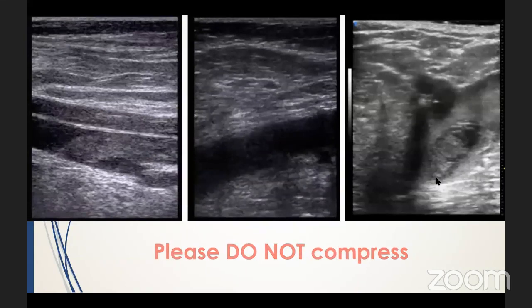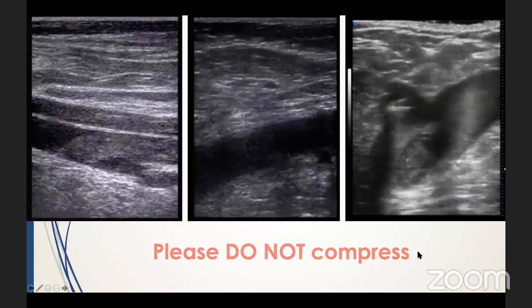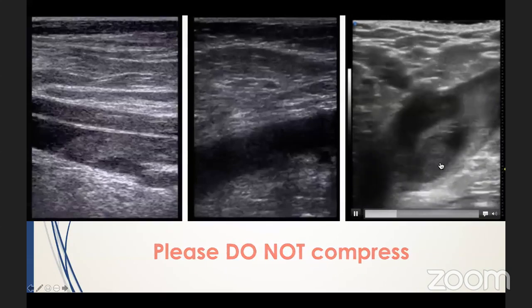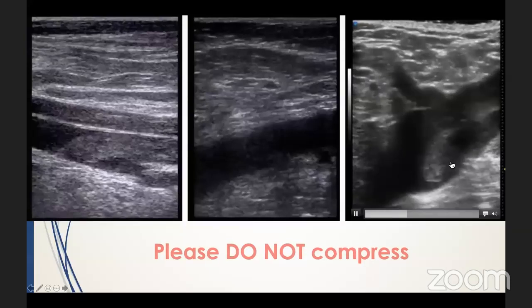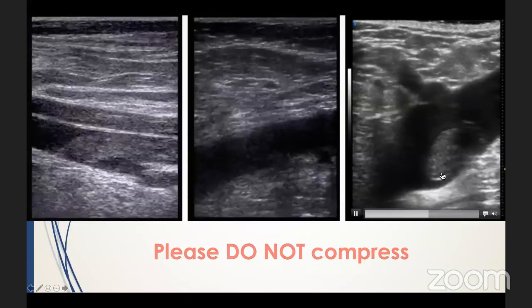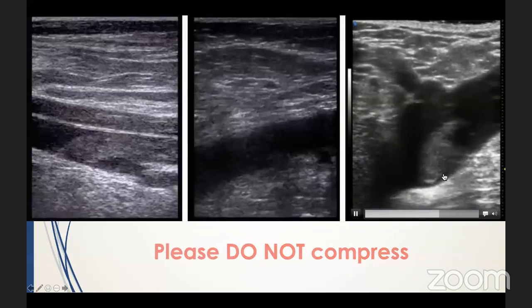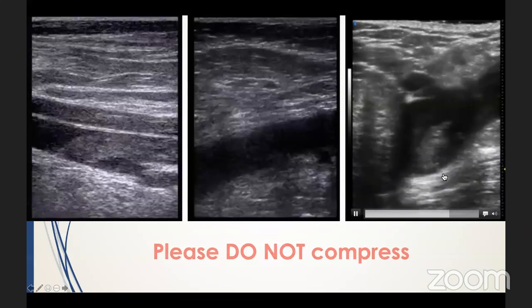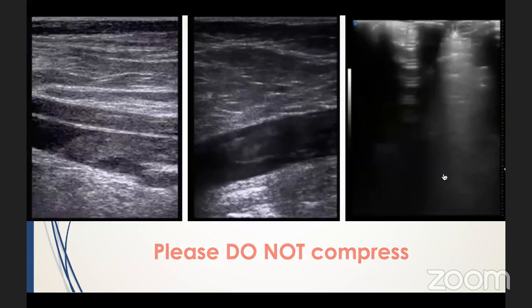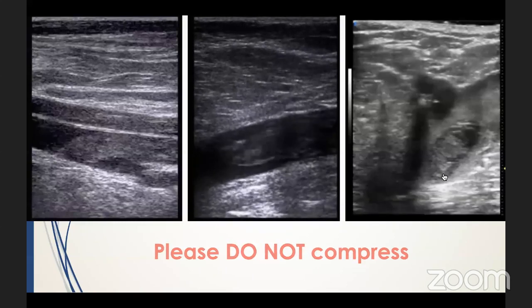Like I said, floating thrombi are quite risky. If you note here, this bit here is like someone calling you to just give a gentle compression in order to let it go to the heart, and then from the heart it pumps to one of the arteries and gets the arteries occluded and causes really, really unwanted and serious life-threatening consequences.